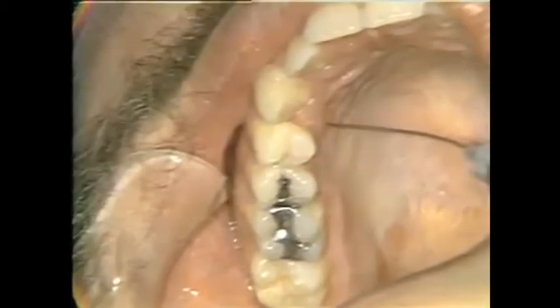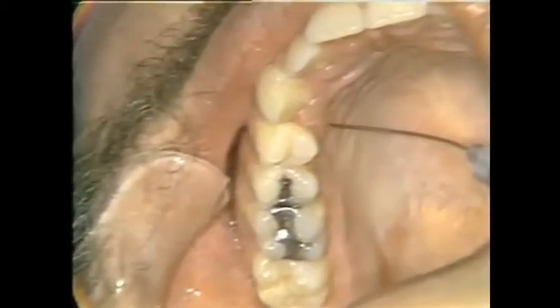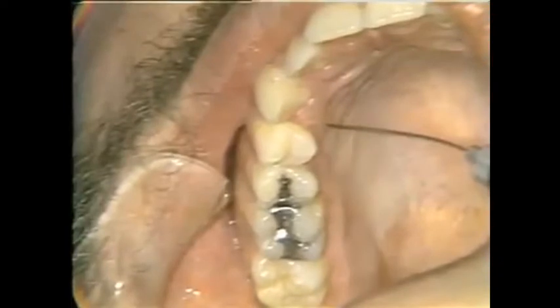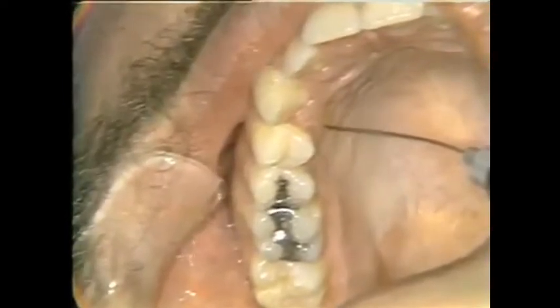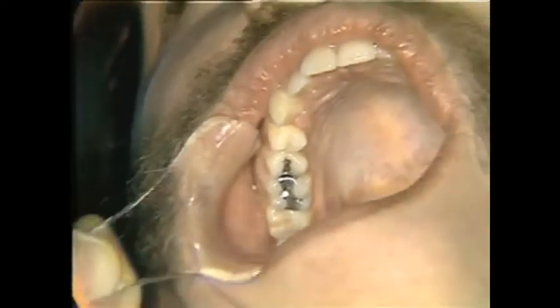And then with quite a little pressure on the plunger, we just literally need to inject a few drops of solution into the palatal soft tissues. And again, they are blanching a little bit. It doesn't show too well here, but they are, believe me. And that's all we need, just a few drops and then out quickly. And that will allow instrumentation on these immediately adjacent palatal soft tissues of the first bicuspid.